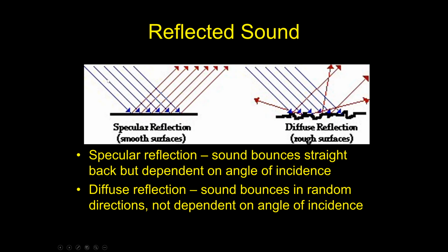If we shot a sound, these incoming blue arrows are our vector of sound wave that comes in and interacts with that capsule of the kidney. We can predict exactly what angle, and almost all of that sound is going to come back at that specified angle and create a nice, thin, crisp white line that we're going to see on the ultrasound picture.